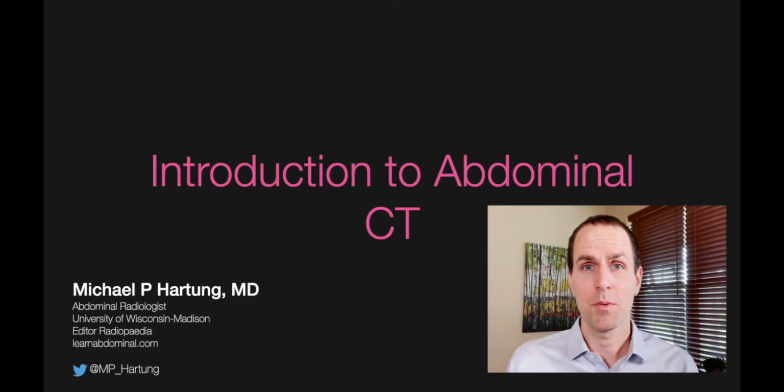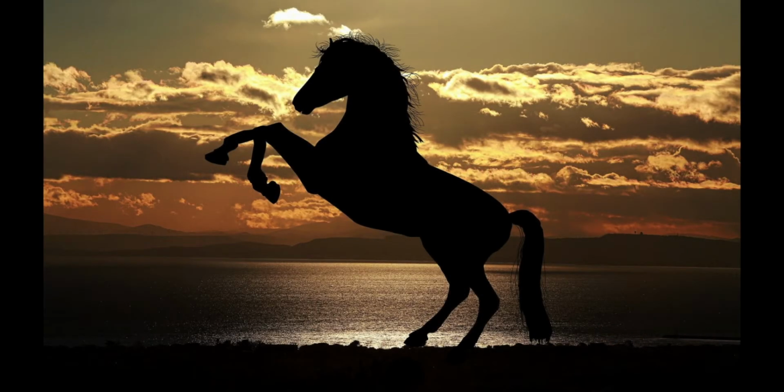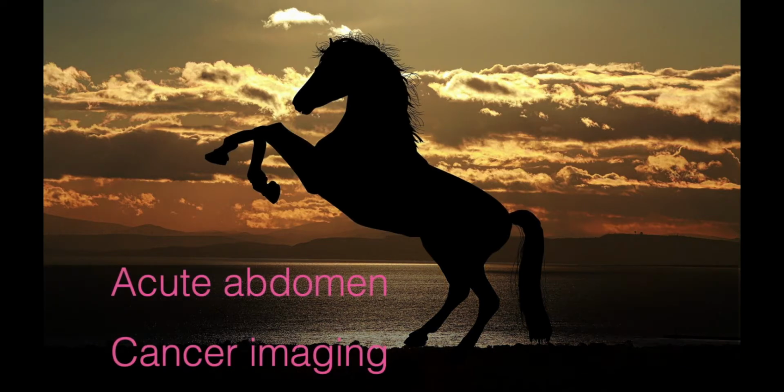I am an abdominal radiologist at the University of Wisconsin and editor at Radiopaedia, and I will be presenting an introduction to abdominal CT. As you are probably aware, CT is the workhorse of abdominal imaging and the highest yield go-to exam for acute abdominal pain and cancer imaging.